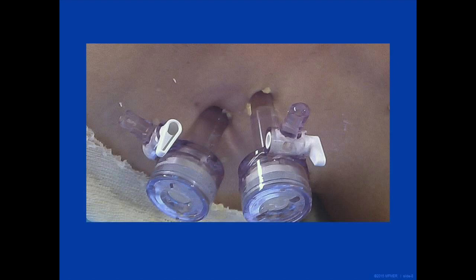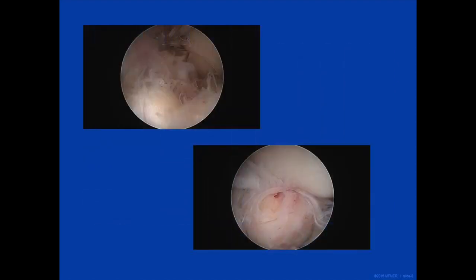The steps are then repeated with a second more anterior and distal portal and a second cannula was inserted. As seen in the figure in the upper left, the arthroscope can then be inserted through either portal for viewing of the posterior compartments of the knee from the posterior medial aspect. One serves as a viewing portal, while the second serves as a working portal. These are interchangeable depending on location of pathology and allow for use of a variety of instrumentation.